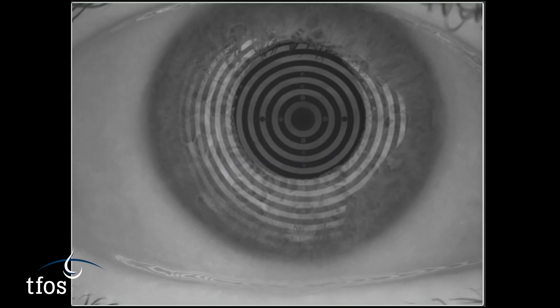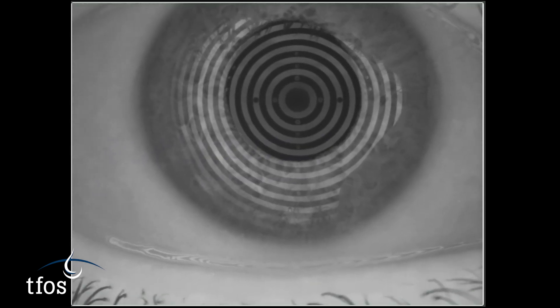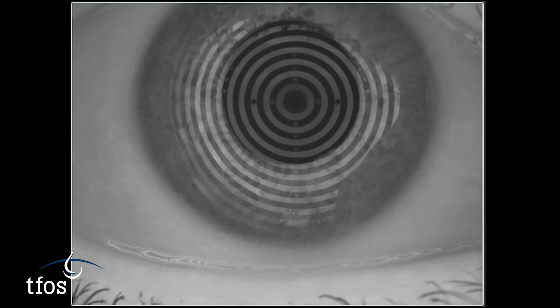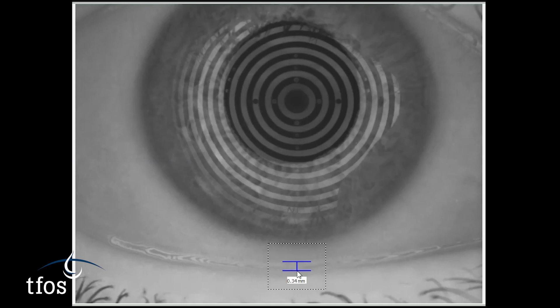Some instrumentation allows the use of infrared to observe the tear meniscus height, which reduces the risk of reflex tearing. Digital calipers can be applied to the captured image to precisely assess the tear meniscus height. The profile regularity should also be observed as an indicator of tear film quality.